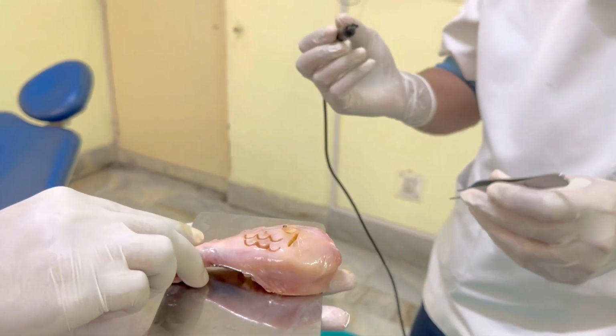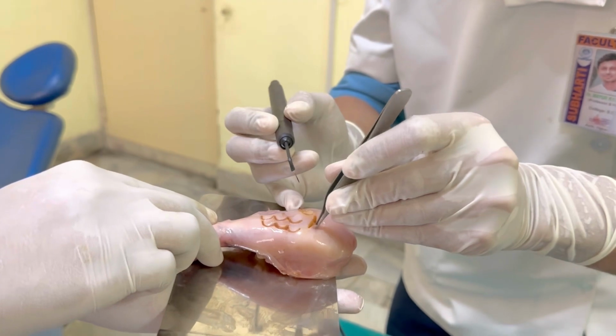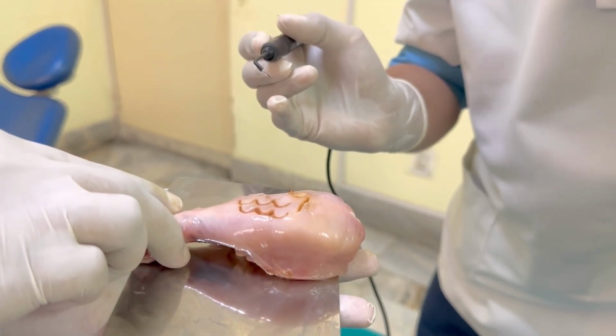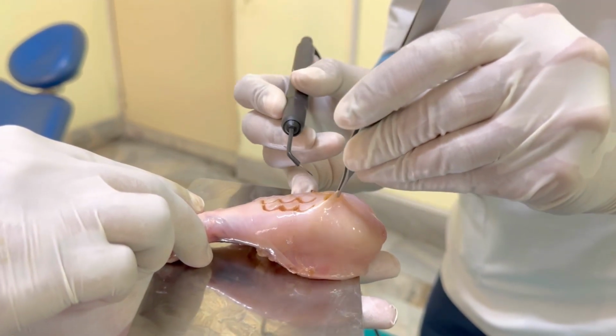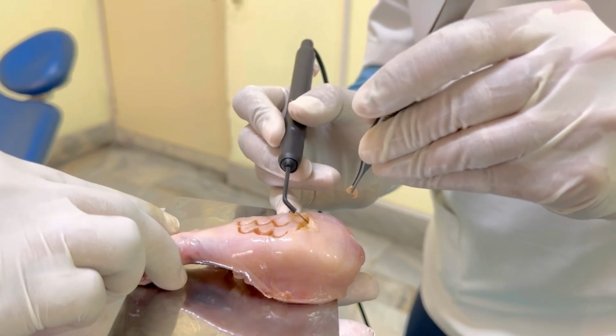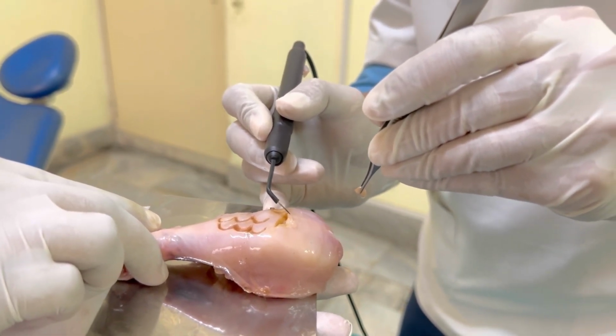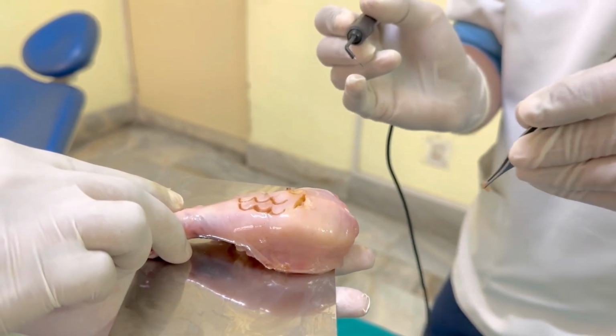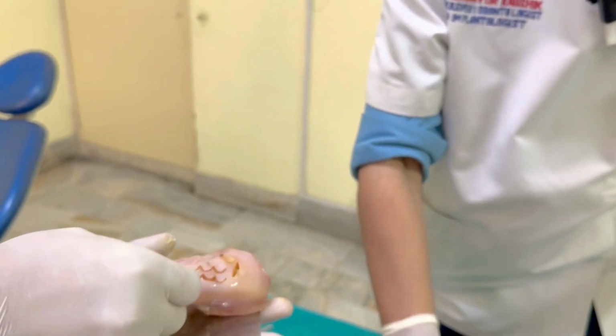I'll demonstrate excision also. So in case we hold it like this, and if I were to use it for excision, that is, I have to remove some epulis, etc., I'll be removing it like this. So this would be a self-sealing area. Hemostasis would be there in this area. So this is the advantage of using electrosurgery.